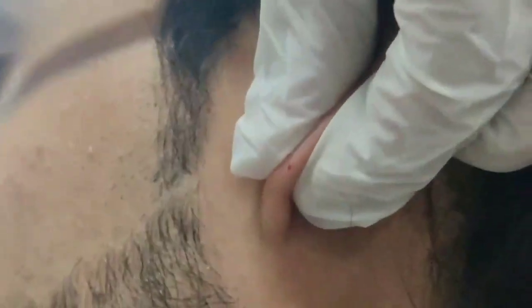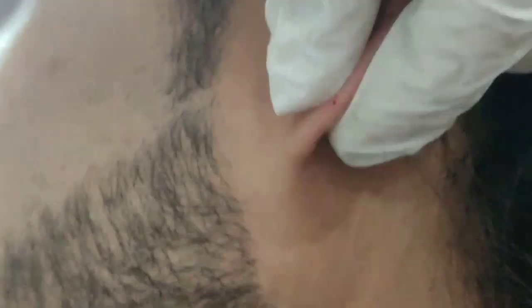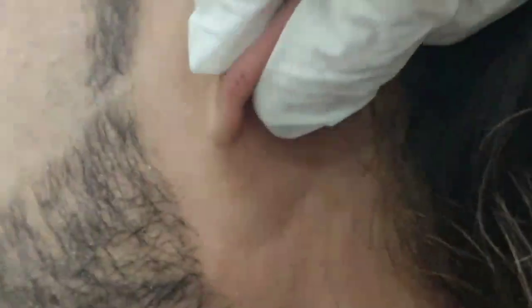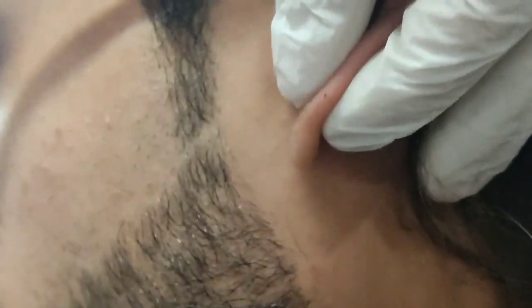Now we start the stopwatch. After every 10, 20, or 30 seconds we absorb the blood using the filter paper, as you are watching. We continue this same process — absorbing blood with the filter paper at regular intervals — until the blood flow stops.